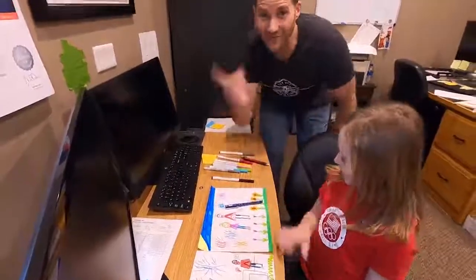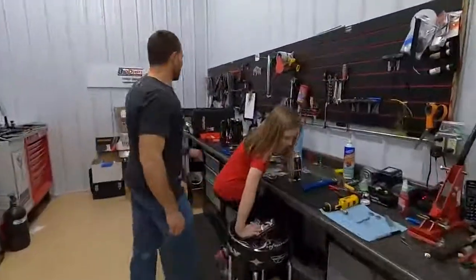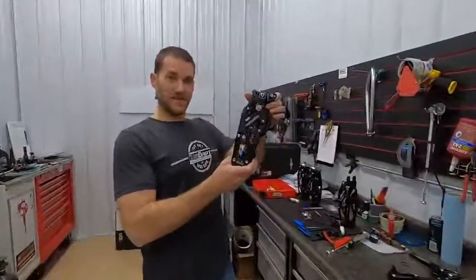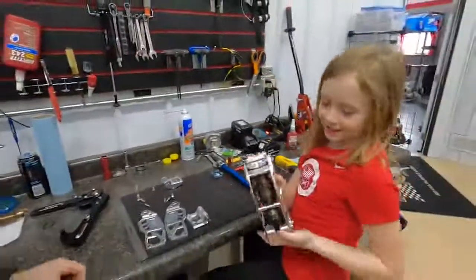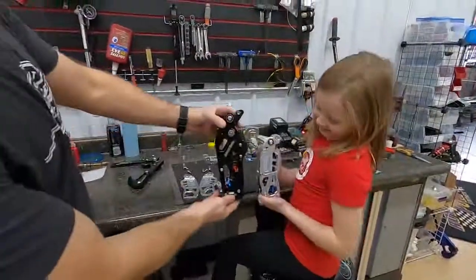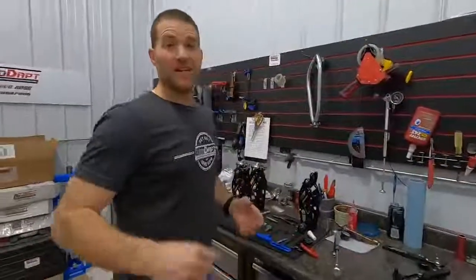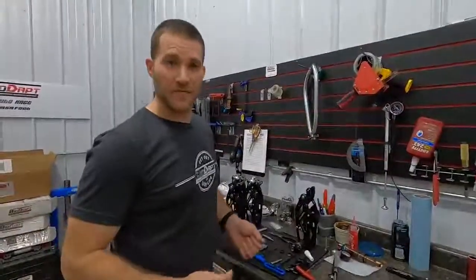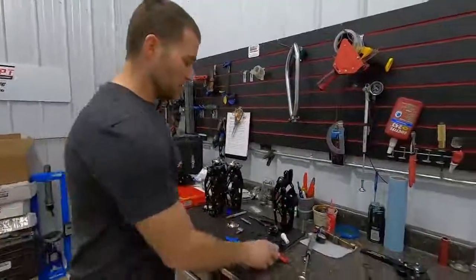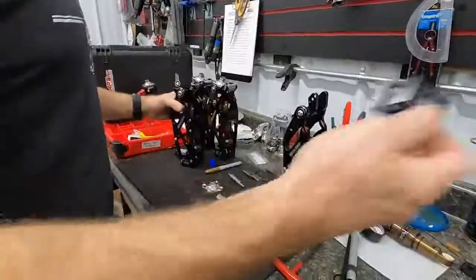This is our workshop where we build all the legs. We've got a few different models — we've got the moto knee right here, the newest latest and greatest, and then Lauren is working on something brand new: the kids' size — it's like a half size now. The process here is: in the office we design them, then we have the parts actually manufactured by big machines, and then we get all the individual parts back here and assemble them all, which is what Lauren is doing right here.